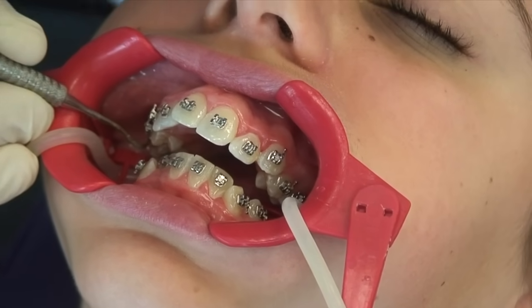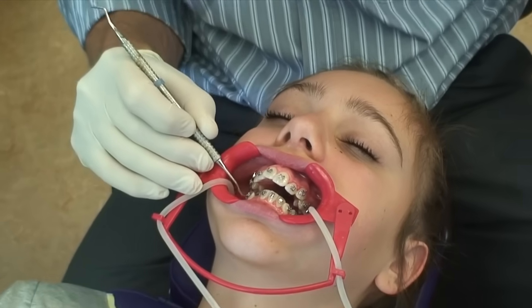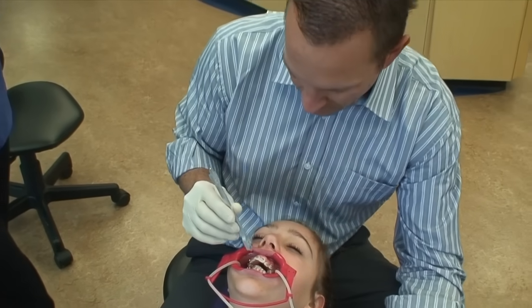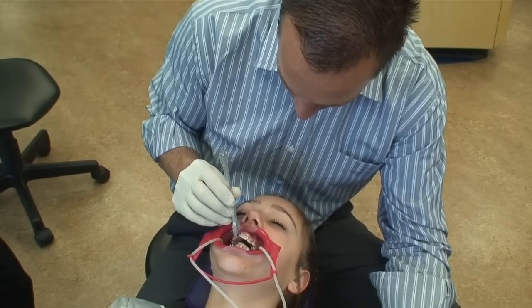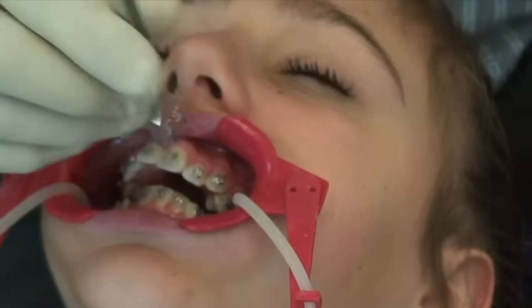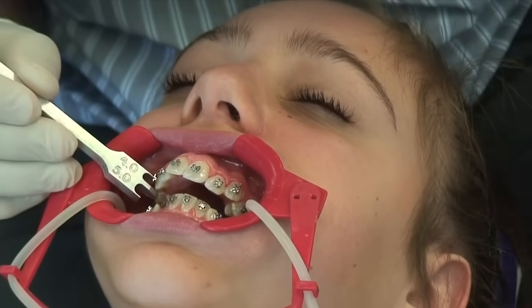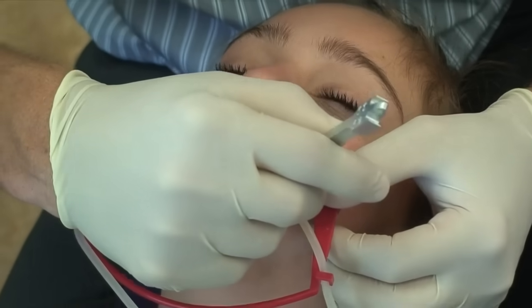Here you can see that we're actually trying to get the angles of the brackets right. So we're positioning them with what we call a scaler. And now we're going in and we're actually measuring the height of each bracket. Along with each tooth having a specific bracket, each tooth has a specific location for ideal bracket placement. And so I'm using this measuring device and holding it at different angles to get the brackets at the right measurements on each specific tooth.